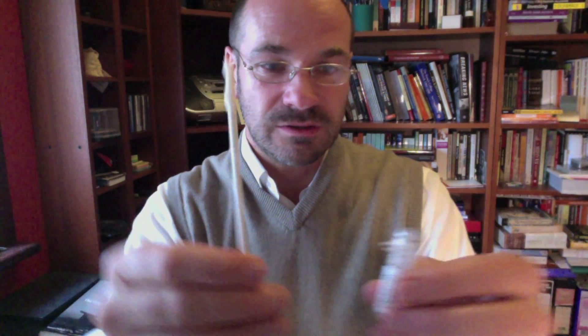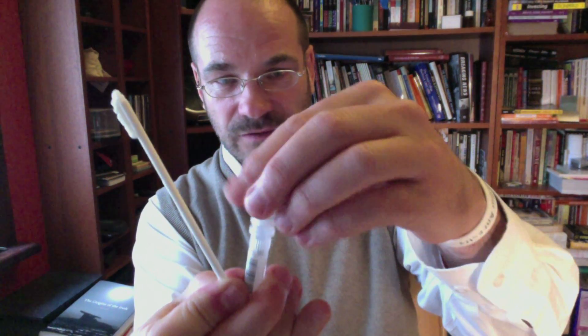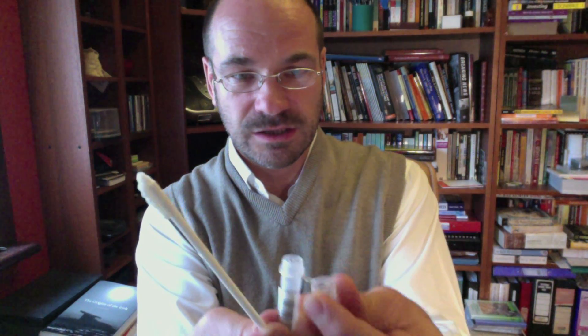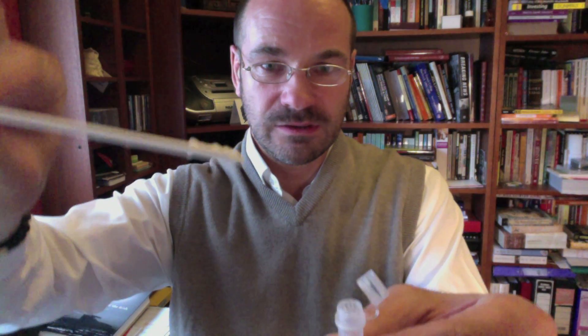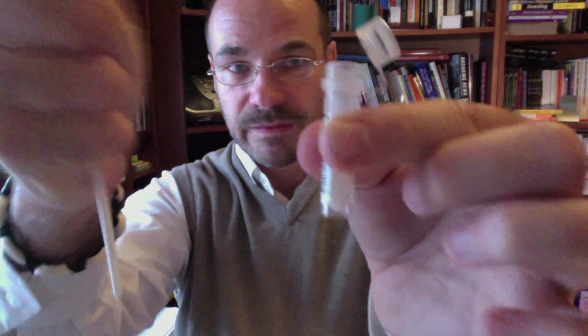Here's the vial and here's the cheek swab. What we're going to do is gently open this vial — a little bit of maneuvering. You could do this beforehand, but again be careful not to touch the vial to contaminate it in any way. Then I'm going to put the top of the swab in the vial and just let it stand there so that I've got my other hand free to push the top of the swab down into the actual vial itself.